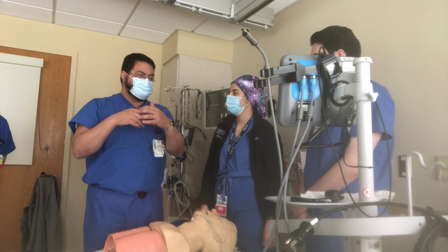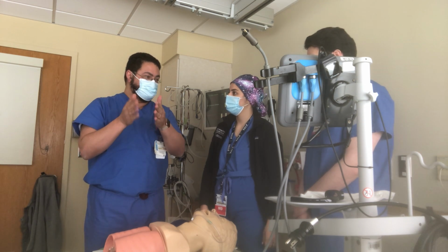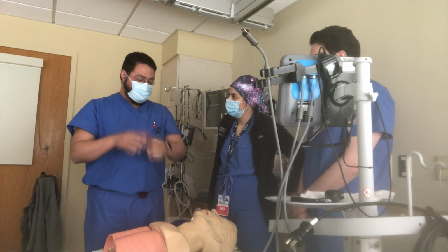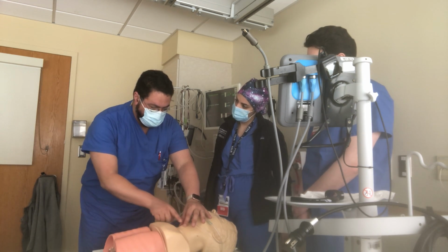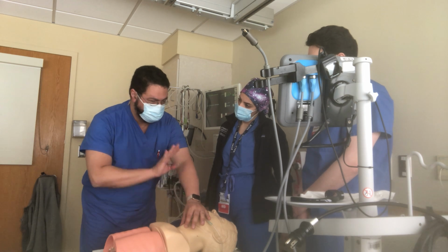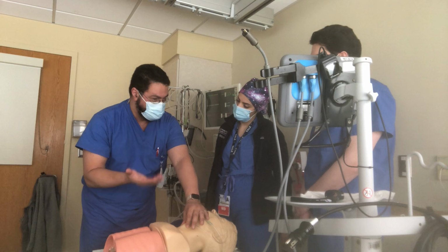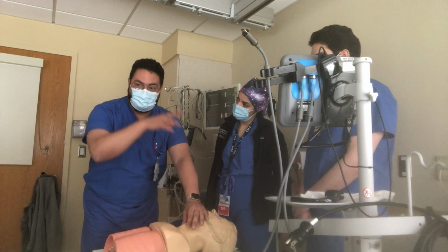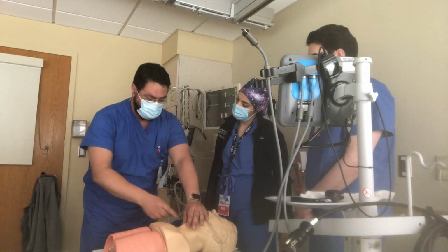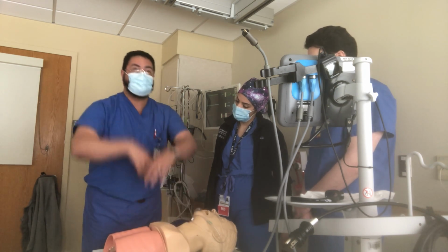By the way, I'm saying it on video. I'm gonna put it on YouTube. Do not listen to the New England Journal of Medicine video that they have. It is horrible. They cut like this, so they can see the cricothyroid membrane. That's not okay, because that wastes time, and that's great for cadavers. But for a human being in a situation where you don't have surgeons, for example, and you don't have cautery, and you don't have light, and you don't have nothing, so you just open like this, fountain of blood comes out.